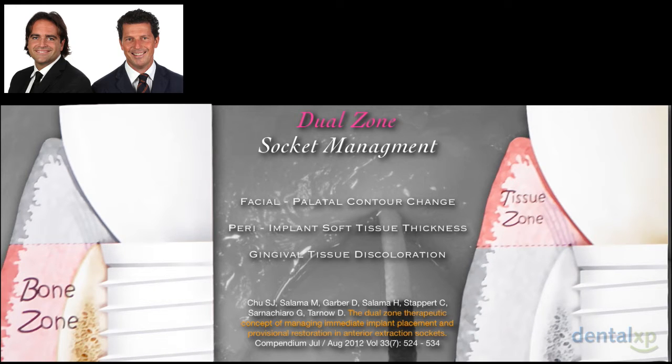the tissue zone, that is everything above the neck of the implant. There they started to collect data on the facial palatal contour change, the peri-implant soft tissue thickness, and the gingival tissue discoloration, which are exactly the three parameters we think are important to know in these kinds of cases.